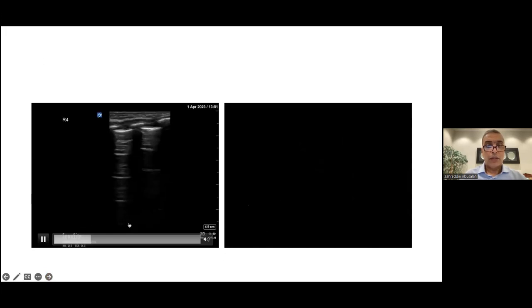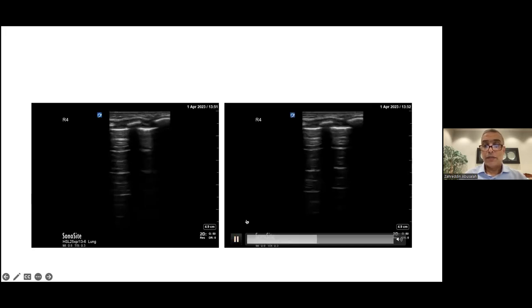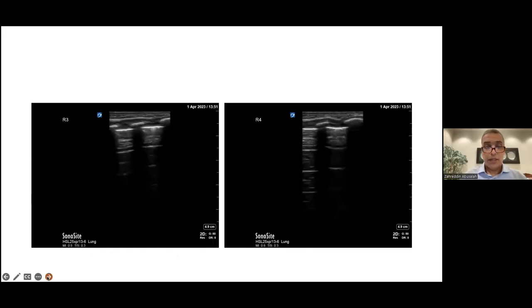And this is R3 as well. You can see the occasional tachypnea. This baby, when the scan was done, was not on any breathing support. He was just breathing spontaneously on his own, maintaining SATs, but this on and off tachypnea was of a borderline nature. Yep. So to me, it looks normal.